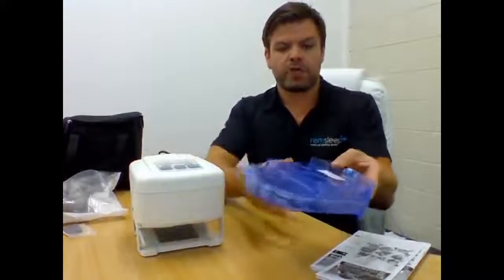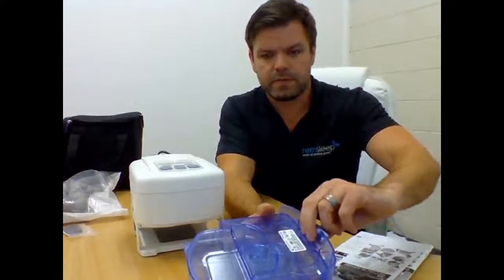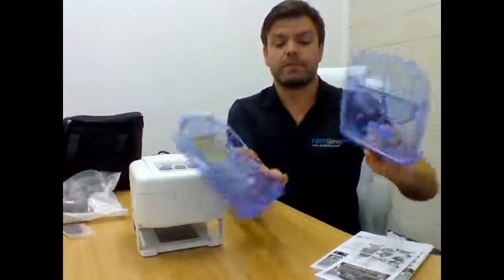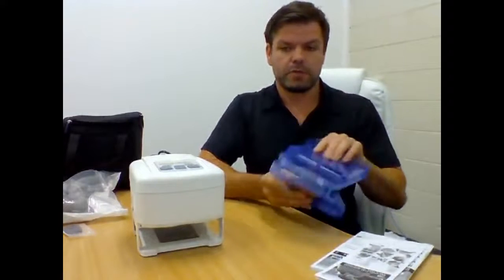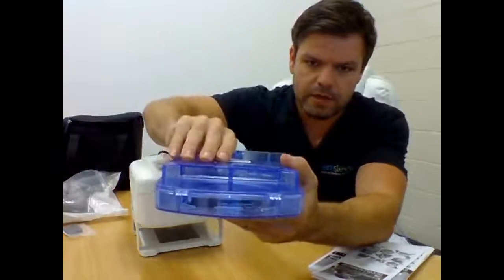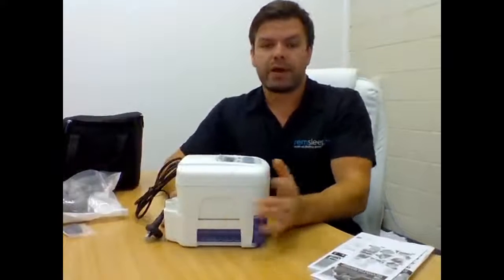To empty this water chamber, at the front here, just next to the blue clip, there's a little latch, and if you just pull it towards the blue clip, it just pops open, which means it's nice and cleanable. So you can get in there, you can wash it out, and it stops it getting dirty. To put it back together, at the front here, there's a couple of little latches, and you just push it down. Slides in.